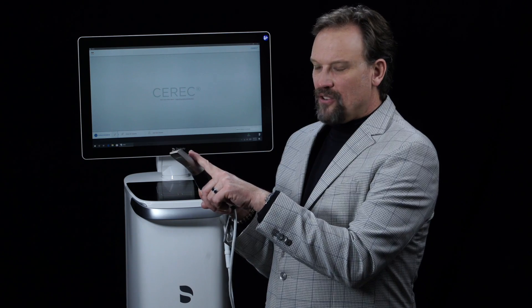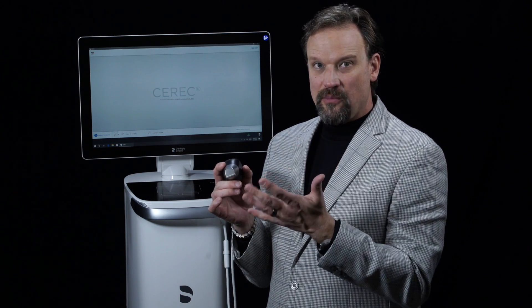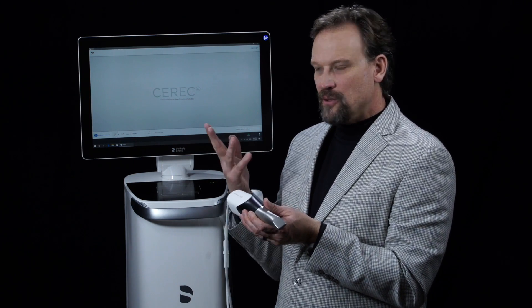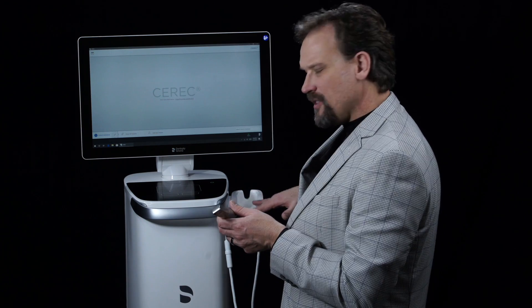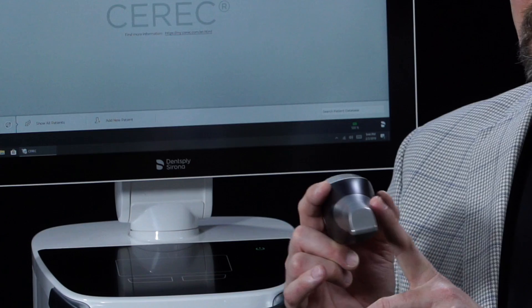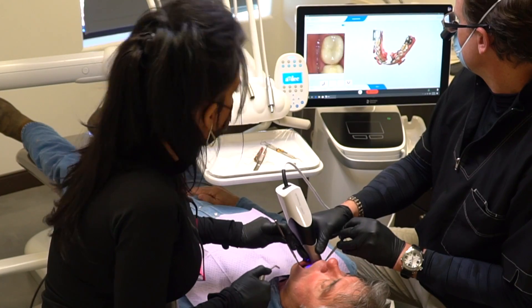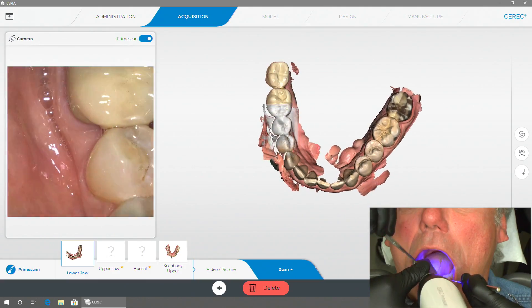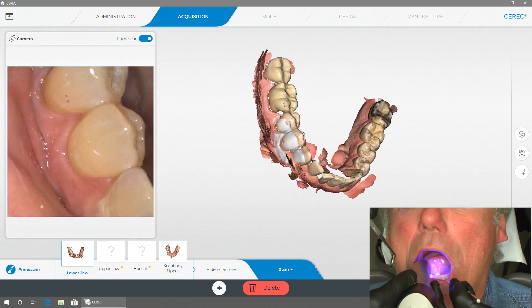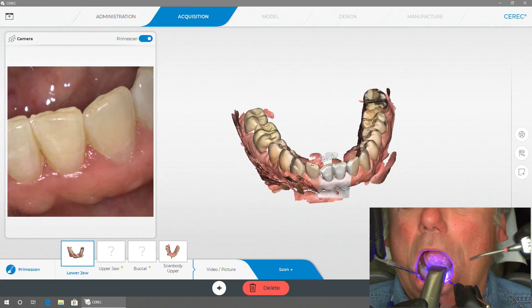There's a heating element within the housing that keeps fog from happening on the glass. For current CEREC owners, you know the OmniCam and BlueCam had a heating element on the external housing, but now it's internal. As the data comes through, it's based off of blue wavelengths — the smallest wavelength of visible light — which is good for accuracy, down to the pixel level.